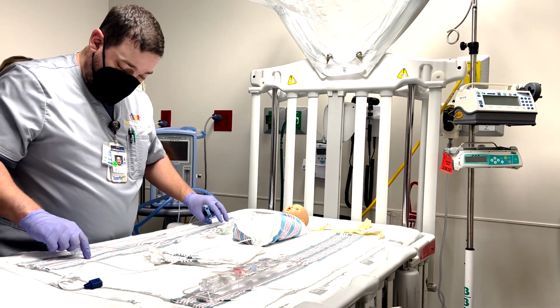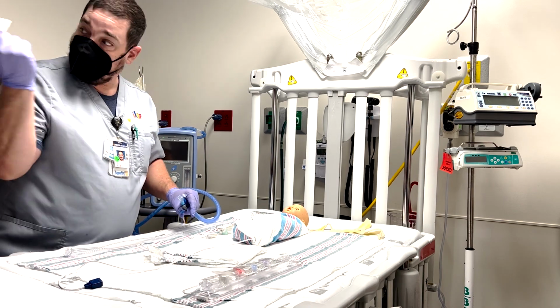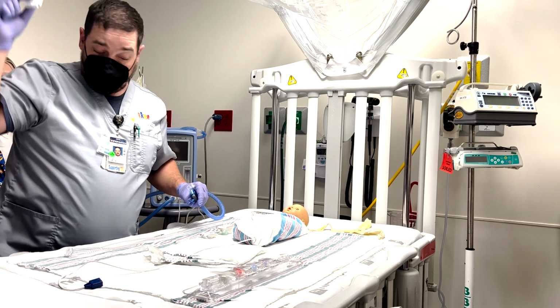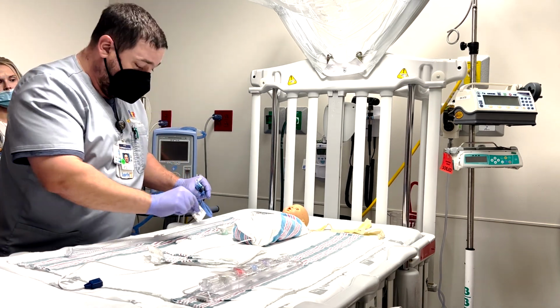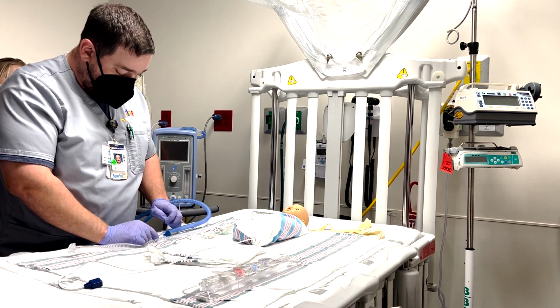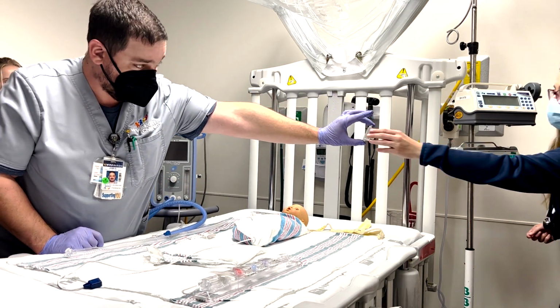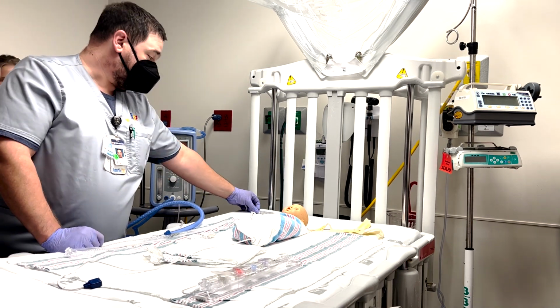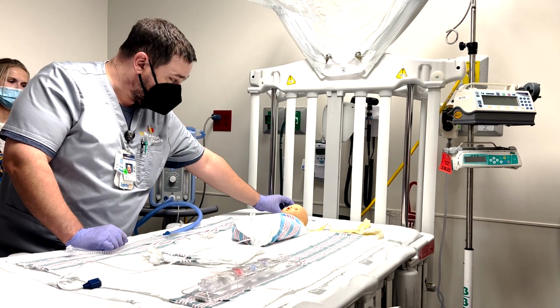It also comes with this generator kit and a set of small, medium, and large prongs. Does that mean that you have to use prongs? No, it doesn't. Because we also have masks available. If you want to go ahead and pass it around. Now that's an extra small. But we also have small, medium, large, extra large, just like the size guide will tell you. All you have to do is ask your therapist.